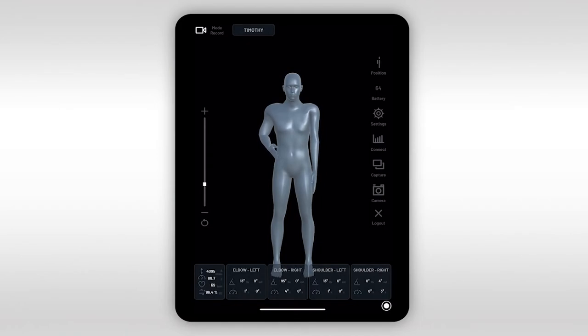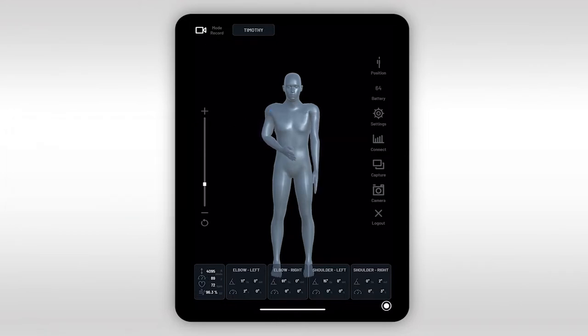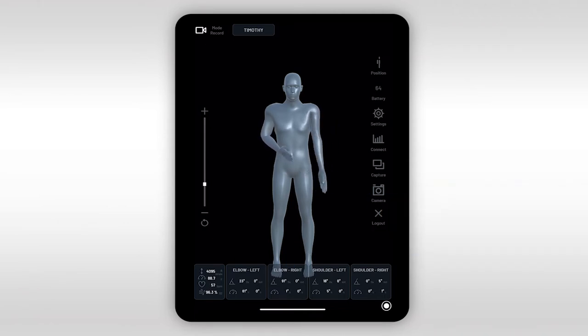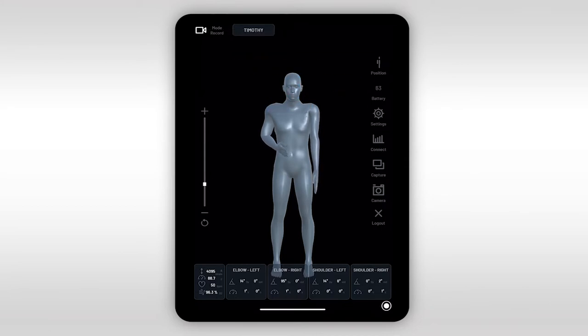Here we can see the main dashboard of our app. It models movement in three dimensions and gives a real-time representation of your patient's motions in the form of a moving avatar supported with objective numerical data. We call this avatar the digital mirror of your patient. Both the practitioner and the patient have access to this dashboard and can see the avatar remotely, simultaneously, and in real time.